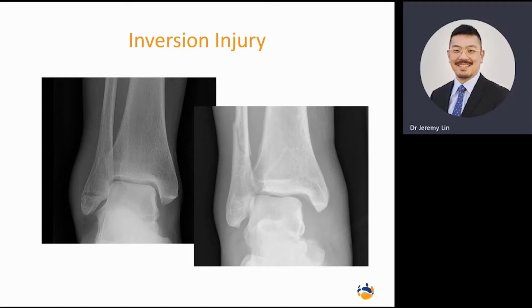And this would be one of the ones where we would, in our report, recommend MRI. So using X-ray alone, what we can tell you is there's a fracture, there's probably ligamentous injury, there's probably chondral or potential for chondral injury. What we can't tell you is exactly how bad it is.